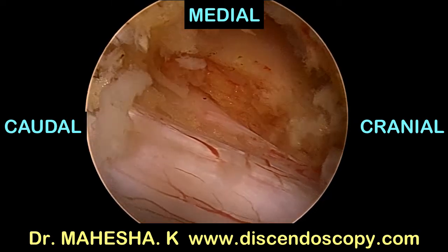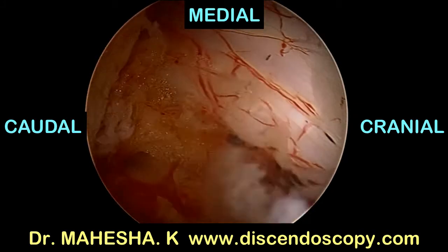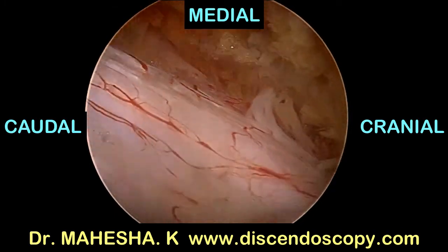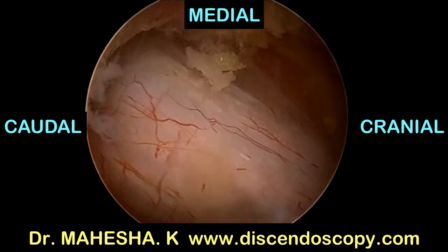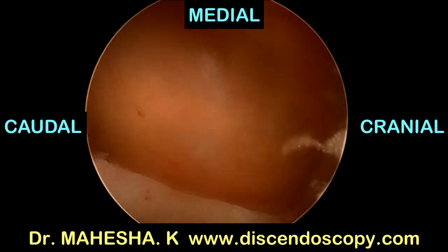Now we can see the contralateral root, ipsilateral root, dural sac, and the opposite side facet joint very clearly. The facet is very well preserved.